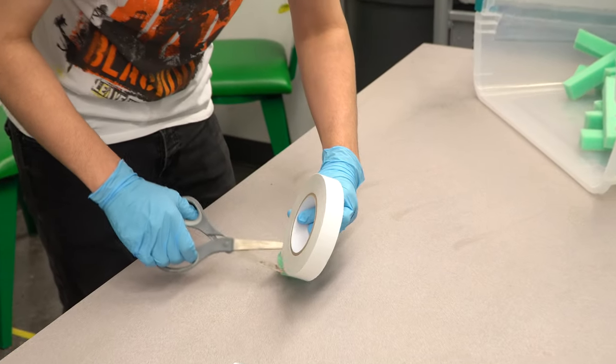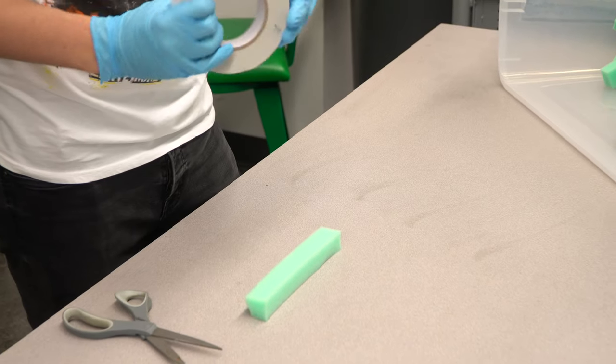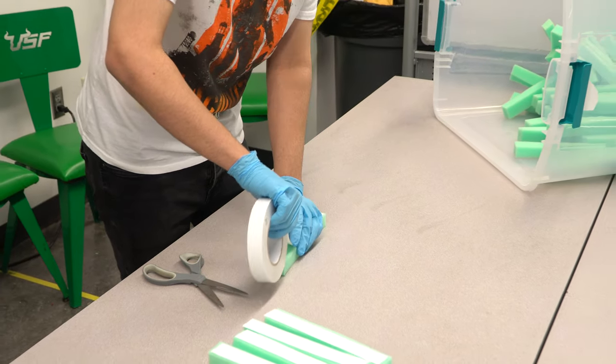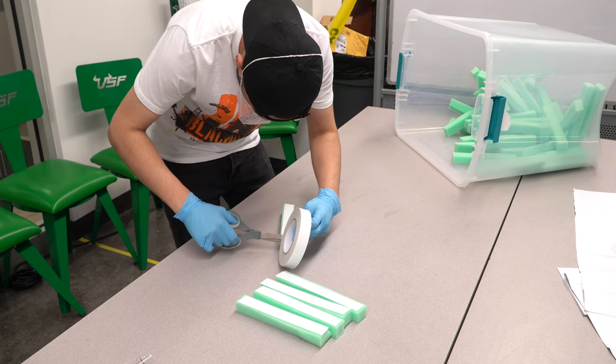After a sufficient supply of foam has been cut, double stick tape is affixed to the foam. It is best to work in batches as this is the method that produces the fastest results. Avoid the temptation to work on individual shields at a time.